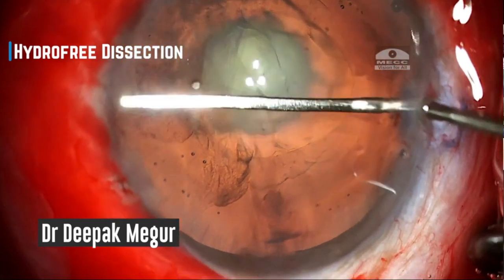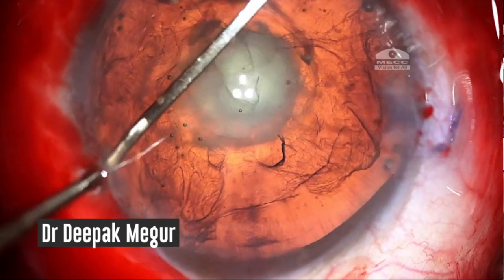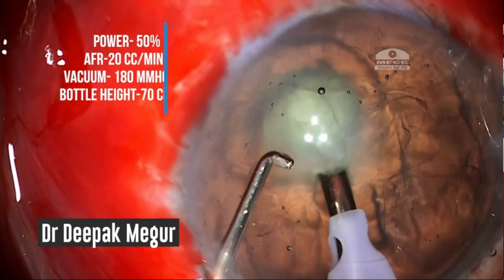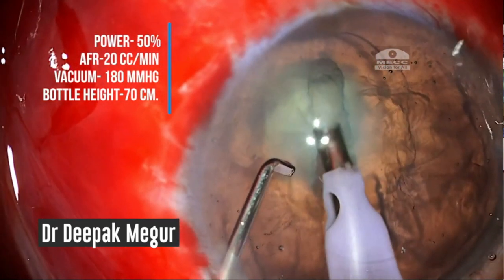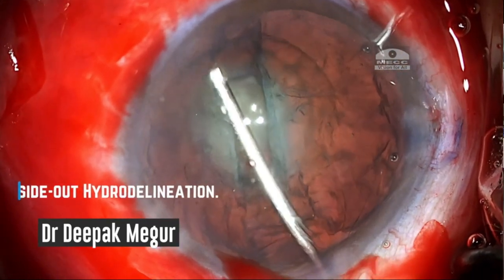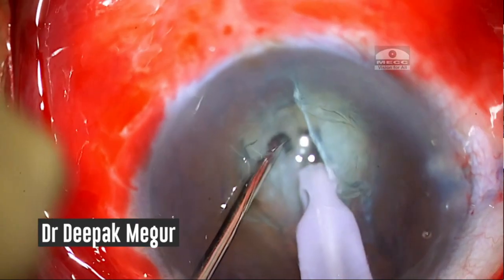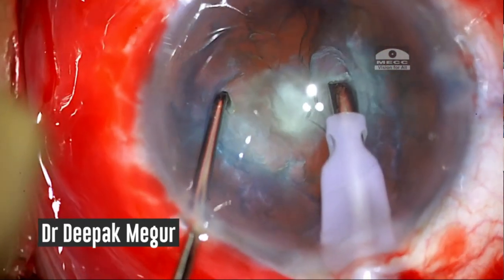I'm not performing any hydrodissection. I'm using a blunt iris spatula to perform a sort of hydro-free dissection. And then I directly proceed to sculpt the central nucleus using very low flow rate, low bottle height, low vacuum, low power. My idea is to perform an inside-out hydrodelineation, as has been popularized by Dr. Vasavada. Once I achieve the hydrodelineation ring, I'm separating the two heminuclei.